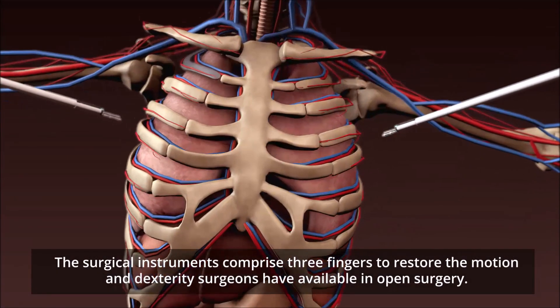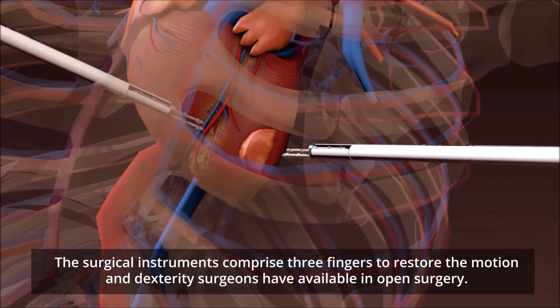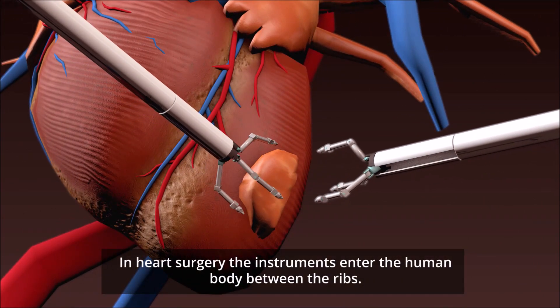The surgical instruments comprise three fingers to restore the motion and dexterity surgeons have available in open surgery. In heart surgery, the instruments enter the human body between the ribs.